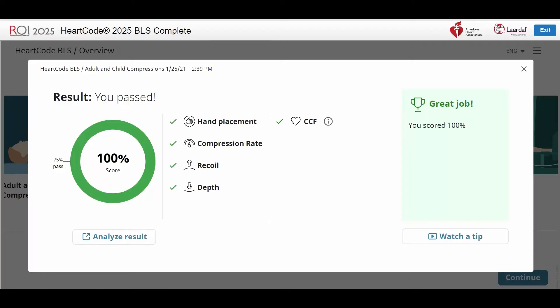Successful feedback metrics. On the left is a percentage score — 100% is perfect and 75% is passing. The Adult and Child Compression Skills Assessment has five metrics contributing to your score: Hand Placement, Compression Rate, Recoil, Depth, and CCF or Chest Compression Fraction.